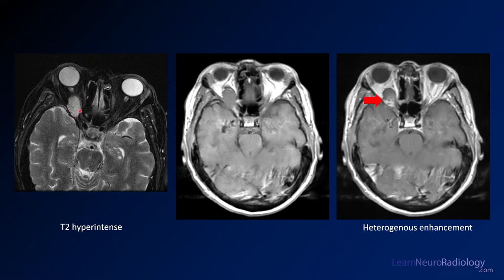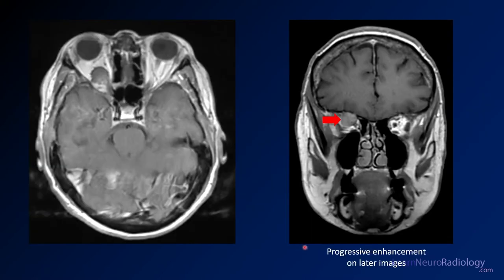On T2, it's pretty hyperintense — very close to the vitreous in the eye or the CSF. On your T1 pre-contrast, it's pretty isointense to gray matter. On your post-contrast, it starts to enhance a little bit with some enhancement around the periphery of the lesion, though not completely — it's a little heterogeneous. This is where you have your real clue to make the slam dunk of this diagnosis.